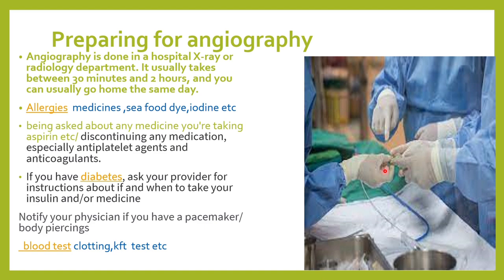So remember, angiography is done in a hospital or a radiology department only, and the procedure can take anything from half an hour to 2 hours, and usually this is an OPD procedure. You can be discharged the same day if there are no major complications, which usually doesn't happen. But remember, this is an OPD procedure. You can be discharged the same day.